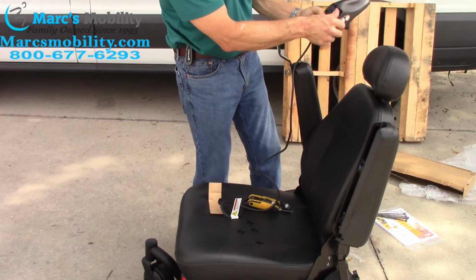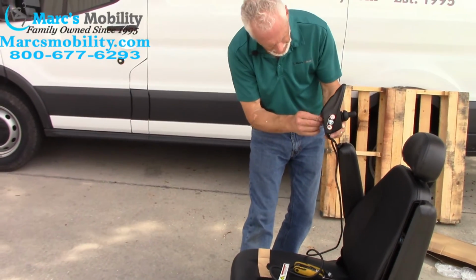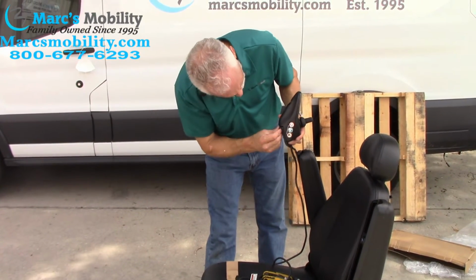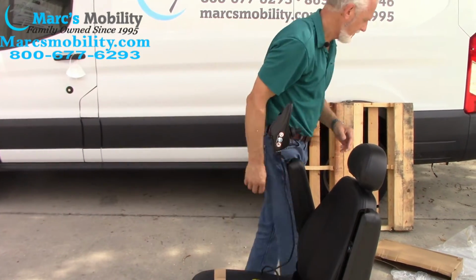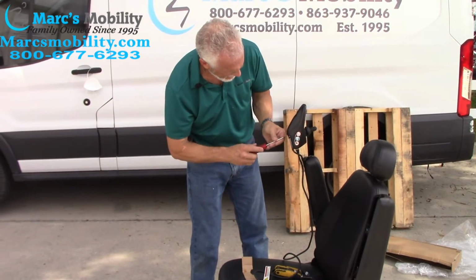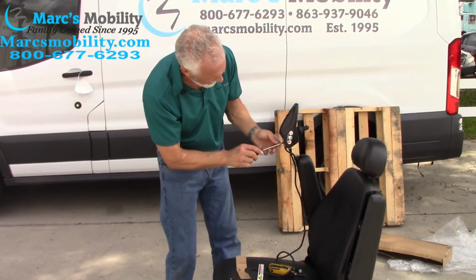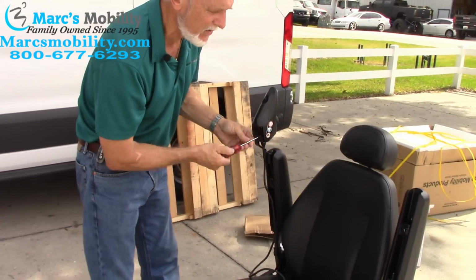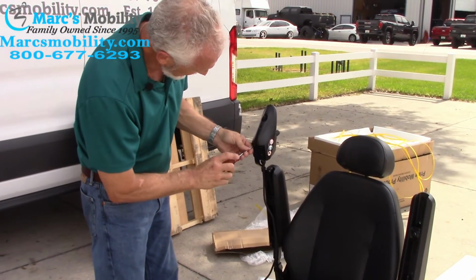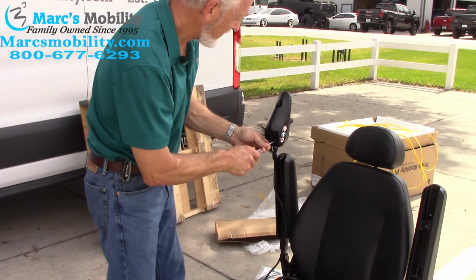Just like that. So you want the holes and the joystick to match. You can do one at a time. You can put your screw through here, through your tab. You can run your other tab from the back in here. Put your other screw in here. Use your Phillips screwdriver. Tighten them up. You don't tighten them up all the way until you have all 4 of them in there. When you have all 4 of them in there, then you can tighten them up, but don't tighten them up too tight, just a little bit. So when you get to the bottom, right there, not too tight, just snug. I know some of you like everything really tight, but just snug.